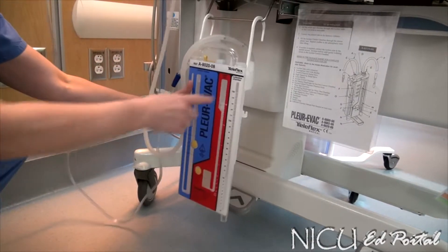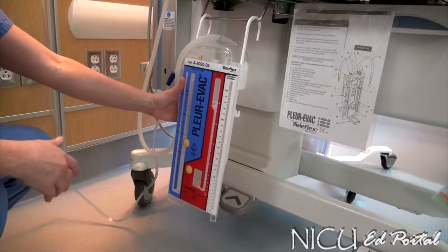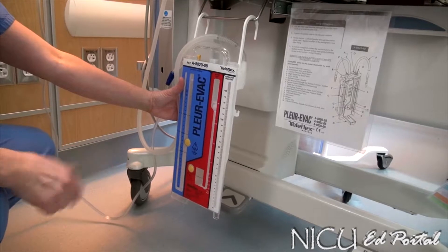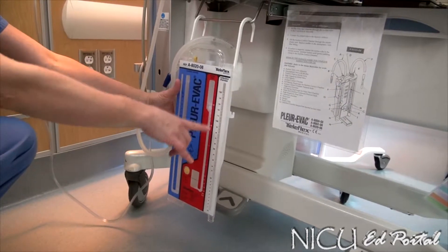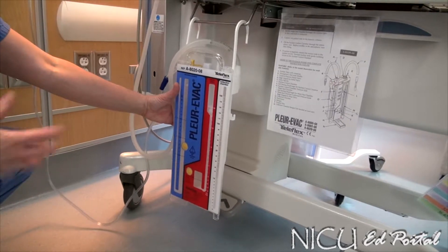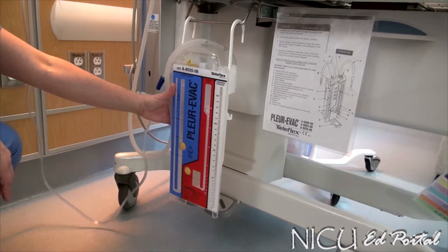We will walk through what the water seal chamber looks like with air evacuated and with a pneumothorax that's still happening. The collection chamber is your last chamber. This is where you would have fluid drainage, and you need to make sure that you're keeping track of the amount and the color. In our unit, we don't see a lot of drainage unless you're dealing with a baby with chylothorax or sometimes our post-op patients.